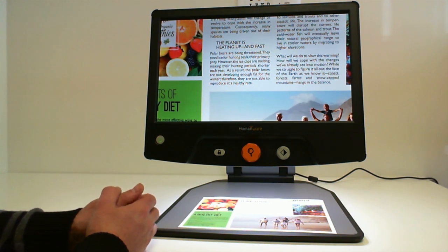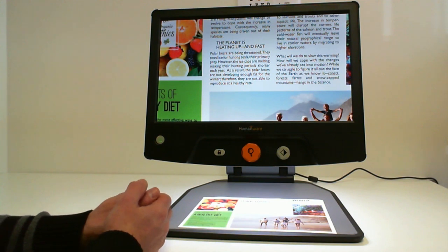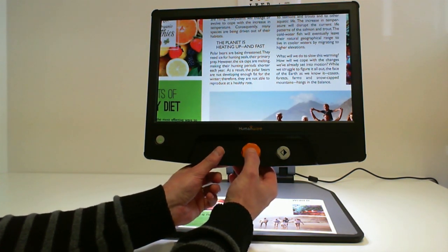In this little tutorial, I will be talking about a new feature in version 1.1 of the Reveal 16. In the Reveal 16, it is now possible to use a shortcut to activate a line or blinds display. The shortcut is a short press on the lock button and the zoom button.